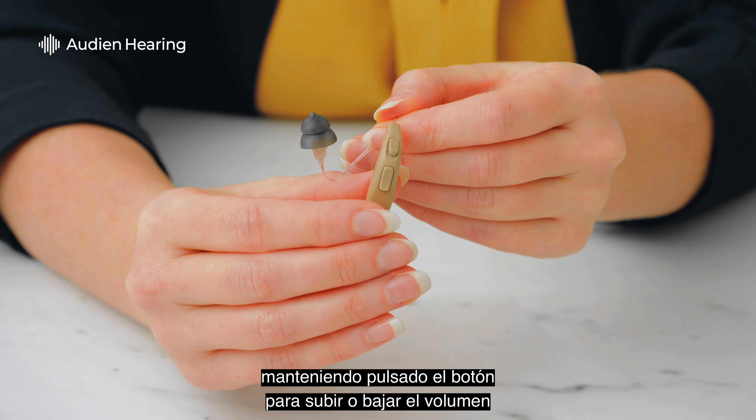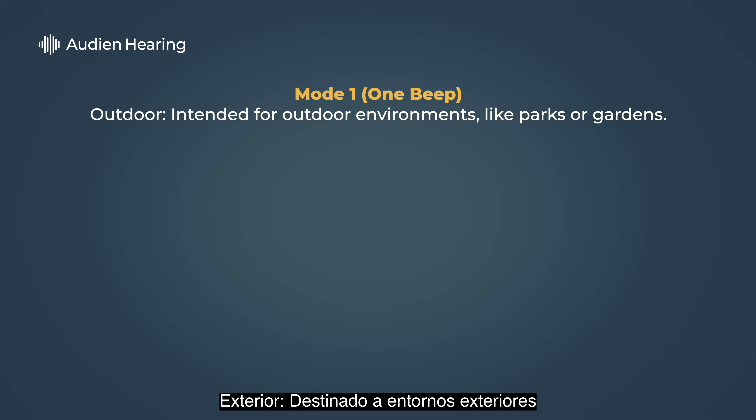Mode one: Outdoor, intended for outdoor environments like parks or gardens.